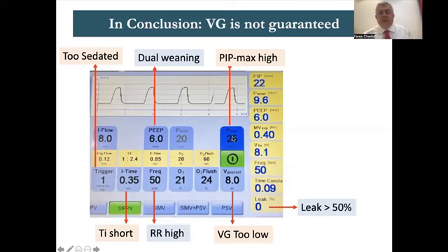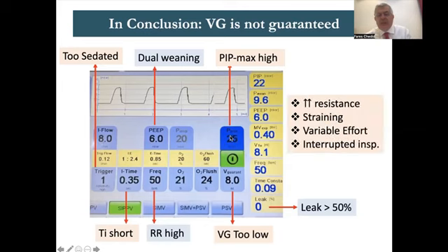And if you set it at 30 or 35 while the PIP is 22, with a very high difference, any time the nurse suctions the patient, or the patient strains, or the machine doesn't receive any information about the VTE, the pressure will start shooting up. So always for safety, please, PIP max 3 to 5 above the measured PIP. This is the PIP measured. This is the PIP max.